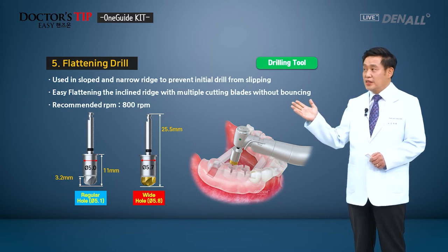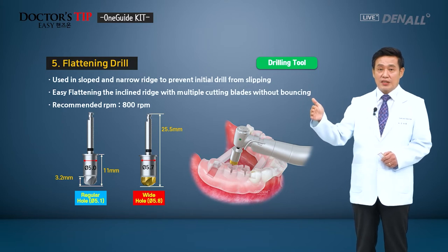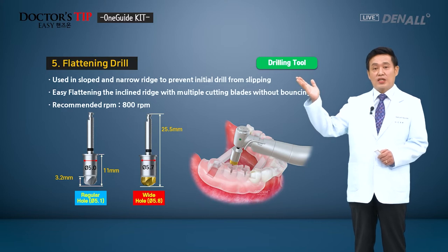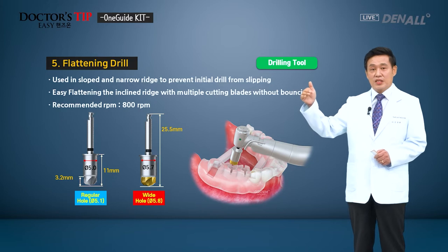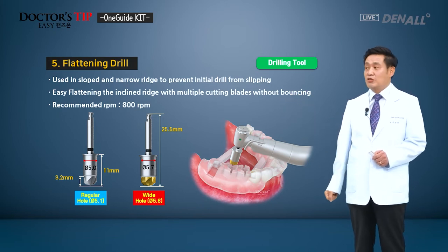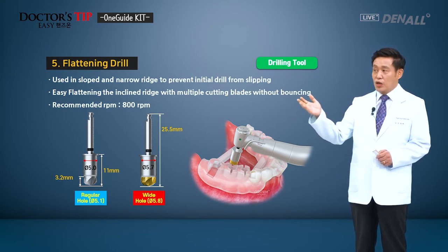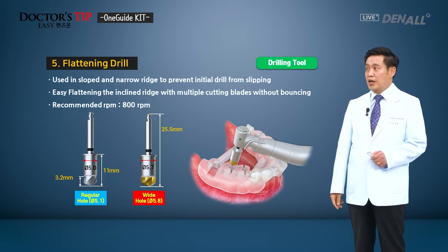Next is flattening drill. Sometimes when you do initial drilling, at times it doesn't go in full length. For instance, there could be a narrow ridge or there can be inclination on the bone. So in those cases, slipping can occur and initial drilling is not done to the desired point. On an inclined ridge or narrow ridge, a flattening process needs to be done, and for that, the flattening drill is available. Regular and wide hole versions are available for this tool as well.